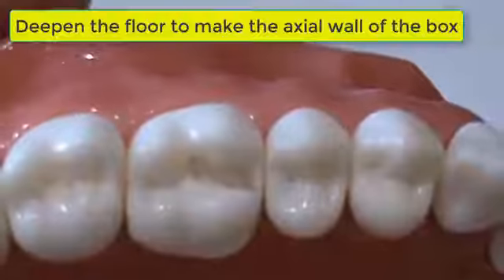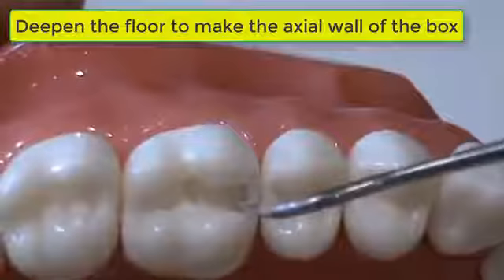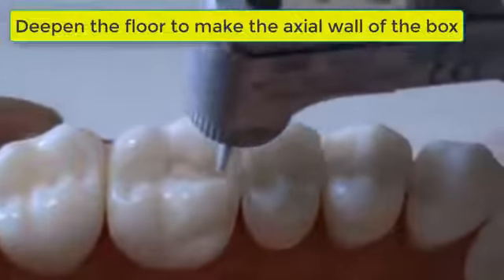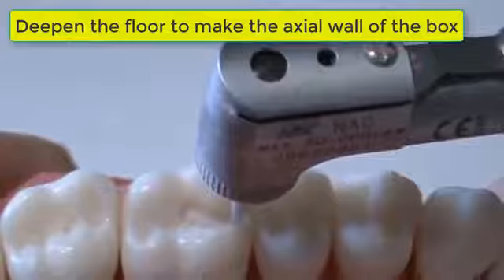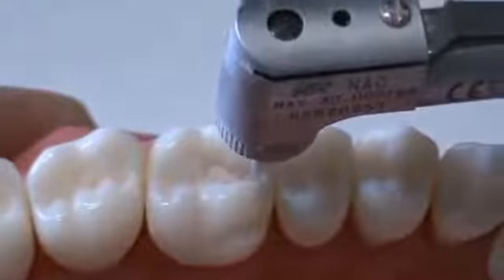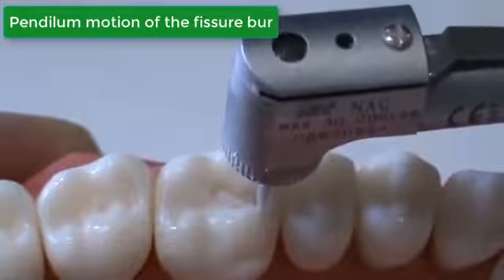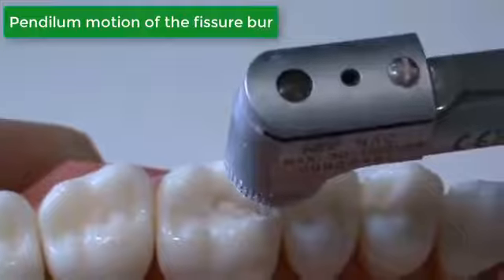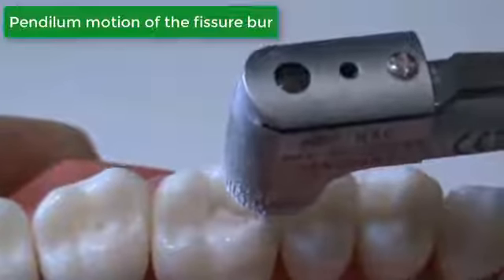Step 2. Making the depth of the box. Place the fissure burr at the mesial marginal ridge and push the handpiece downwards to create the axial wall. Notice the pendulum action of the handpiece.